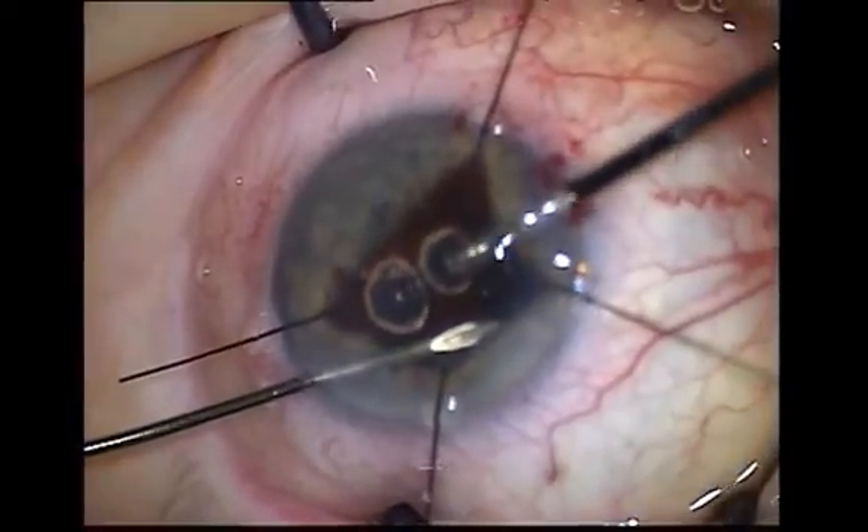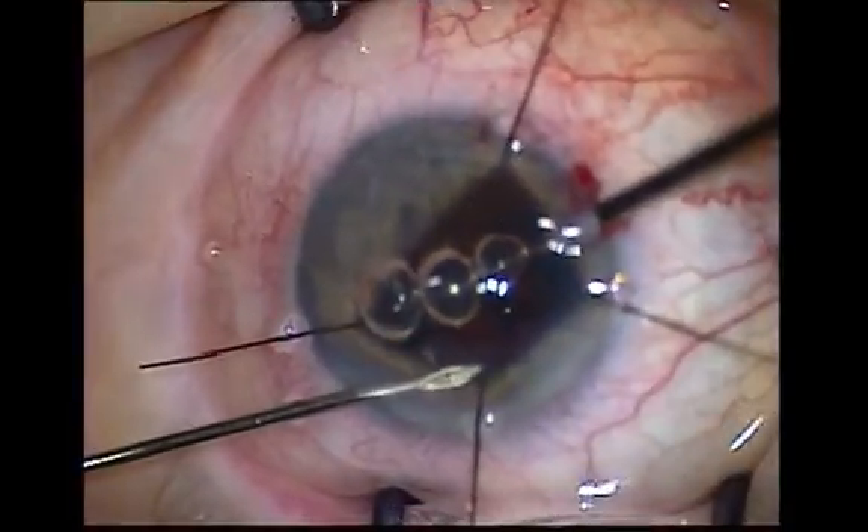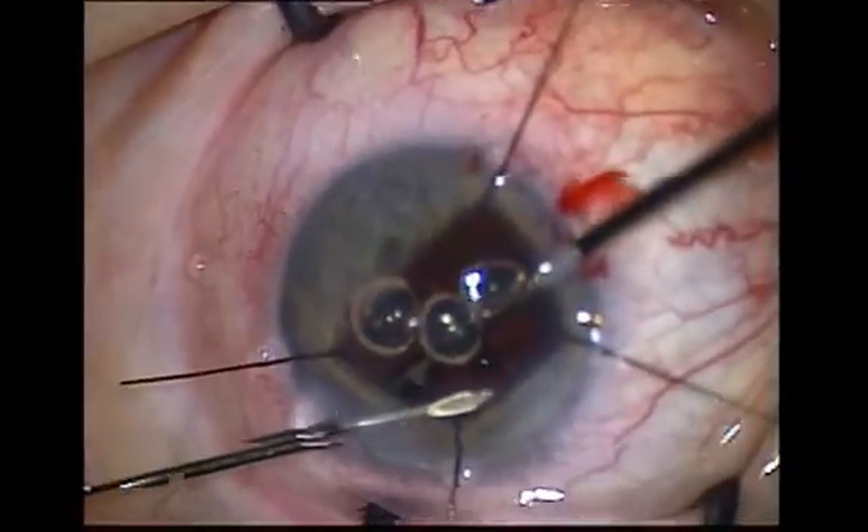Always check the corneal section and paracentesis, as vitreous often is trapped at the edge of these. Continue until all vitreous is cleared.